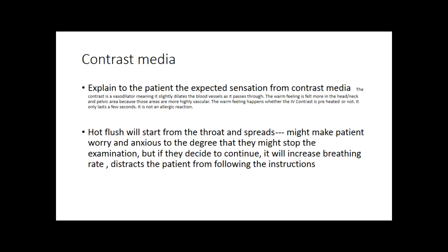Contrast media. Now, there is a controversy about explaining to the patient the effect of contrast media. Several books have different theories about it. Some of the textbooks say don't tell the patient about the effects of contrast media. If you tell them that they will get a hot flash, they will feel it. If you don't tell them, they will not feel it.